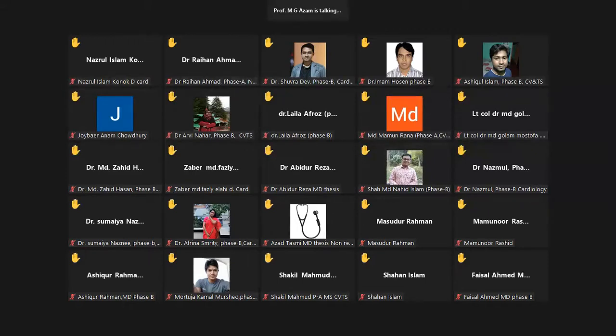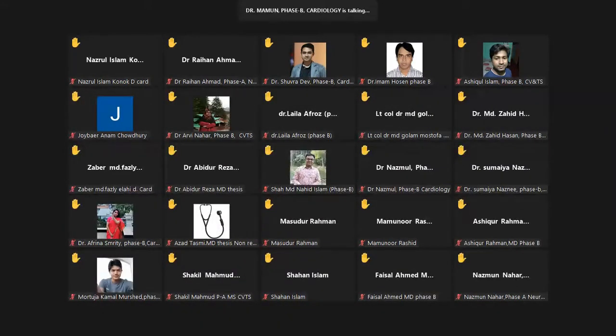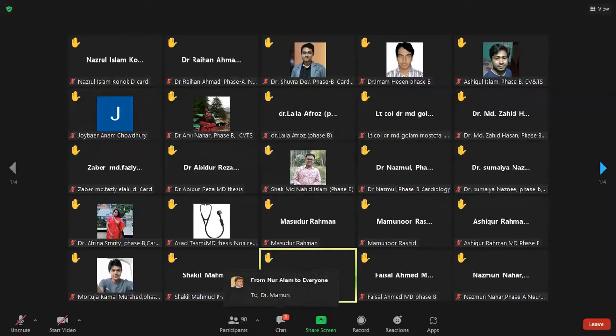Okay, what is the importance of knowing the De Winter sign or De Winter ECG? The importance of this De Winter T wave is that it is an STEMI equivalent, and we should prompt an immediate invasive strategy.